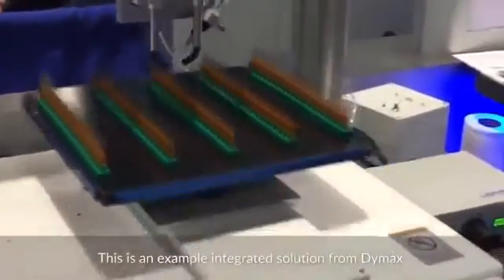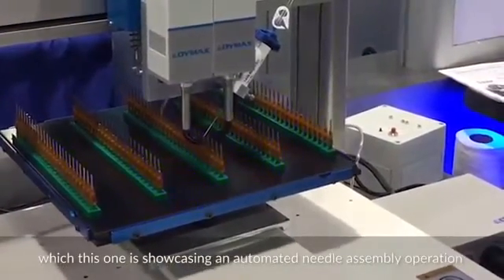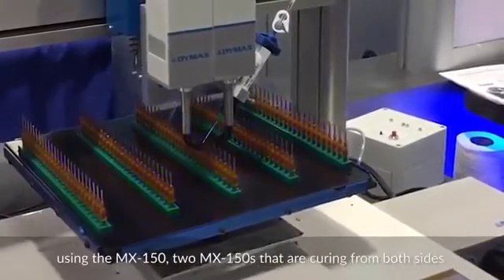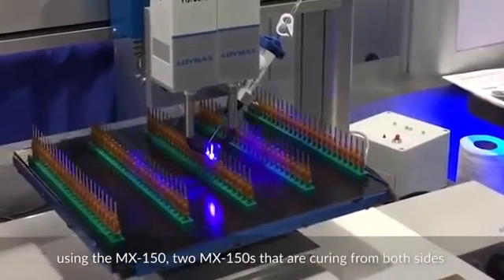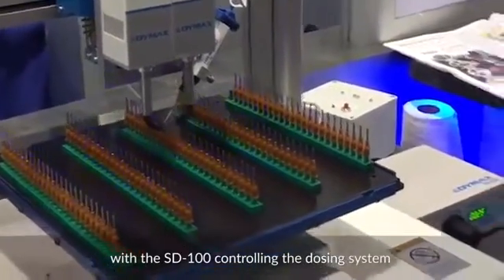This is an example integrated solution from Dymax, showcasing an automated needle assembly operation using two MX150s that are curing from both sides, with the SD100 controlling the dosing system.